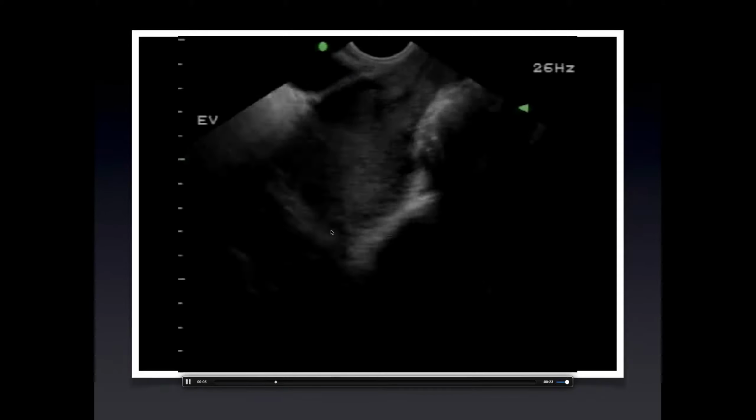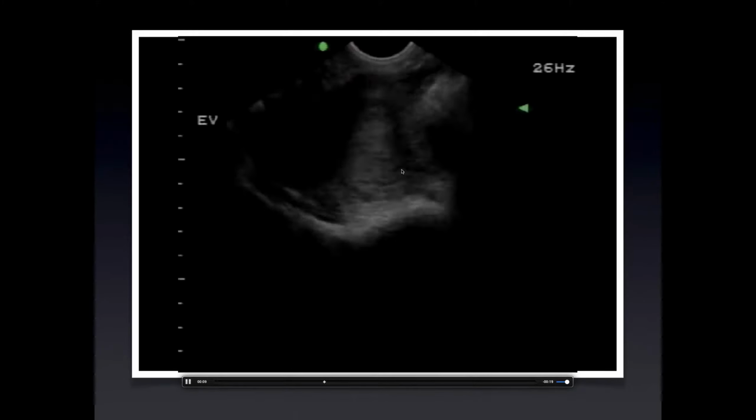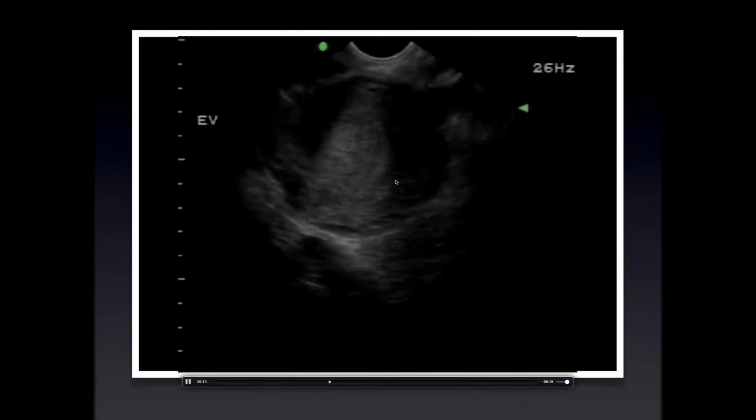This one's actually not located within the tube. We can also kind of see that the endometrium points towards this lesion. It does not contain this lesion, it points towards it. Let's look at that again right here. See that endometrium not surrounding the lesion but pointing towards it.